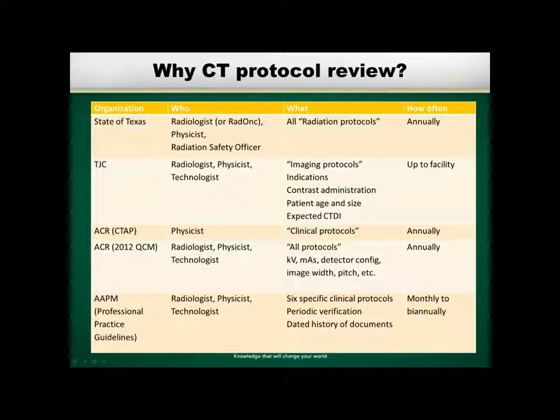AAPM, the Professional Guidance Practice Guidelines, it's a very good document that details in much closer detail, as you would expect, than these other recommendations and requirements. Their recommendations are that things be reviewed monthly to biannually, depending on circumstances.